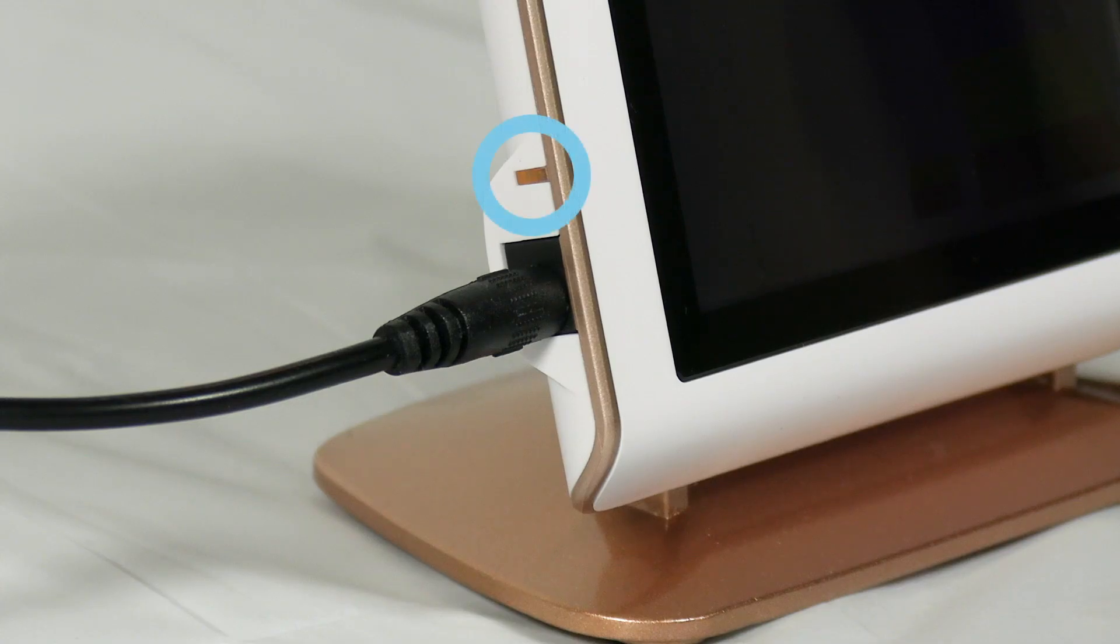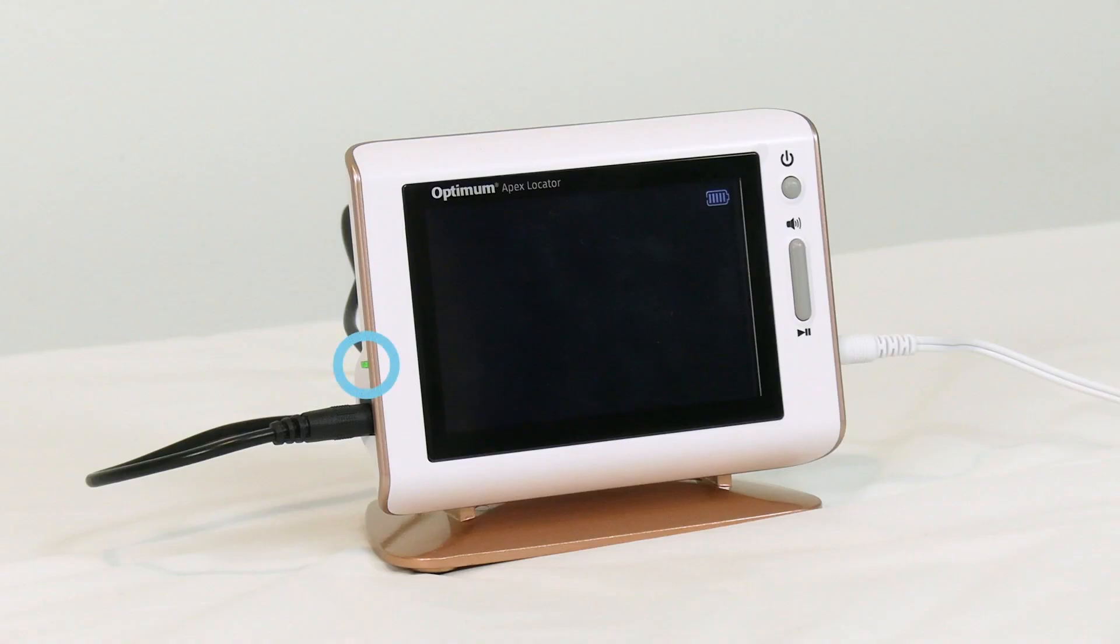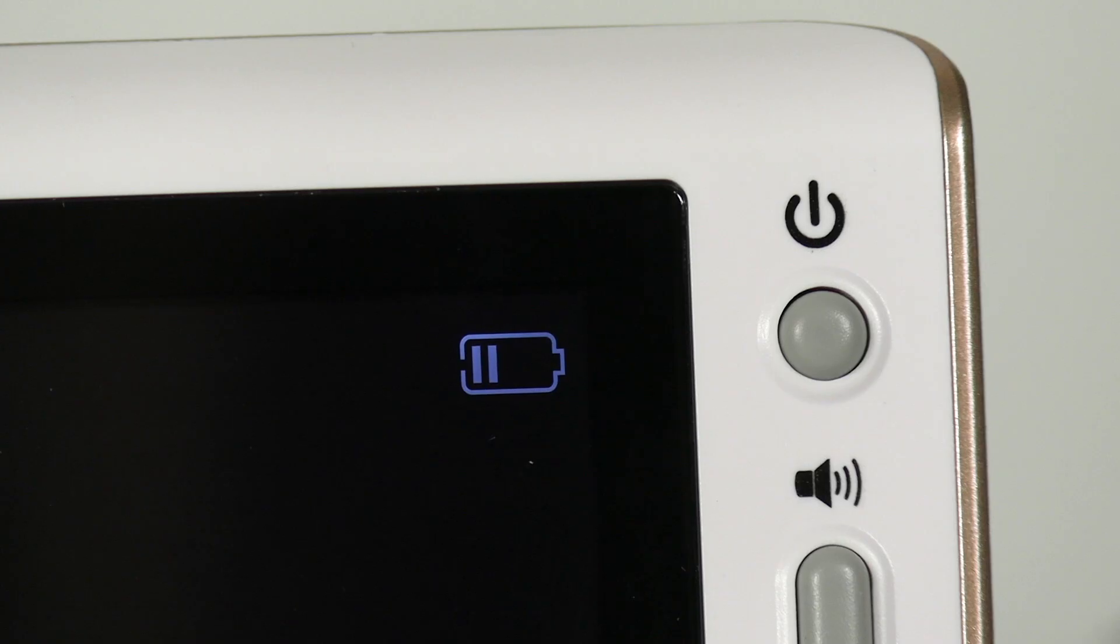The yellow indicator display confirms the device is charging. When the yellow indicator turns green, the device is fully charged. It may take up to 120 minutes to charge fully.